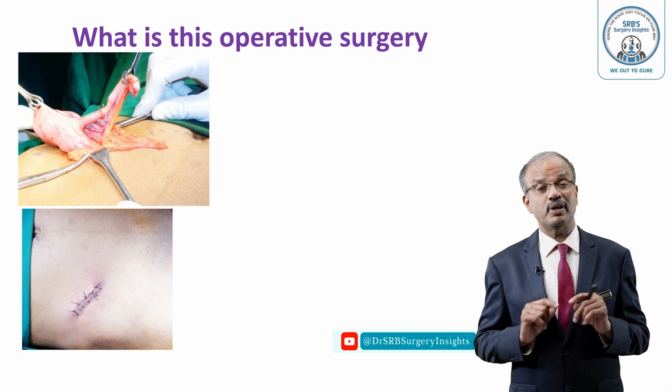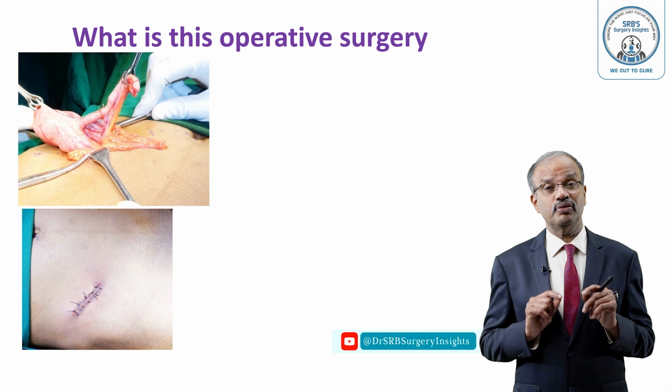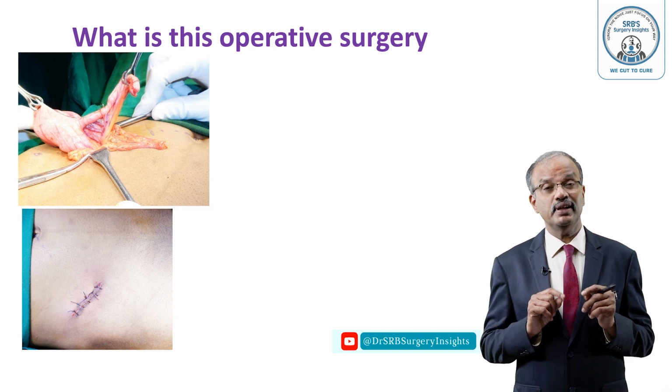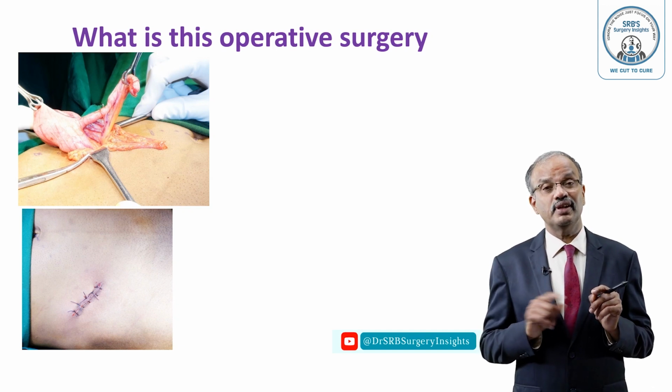Peritoneum, shiny, pearly white peritoneum is identified. It is held with the artery forceps. Bowel should not be held; be careful, you have to feel it. 2 artery forceps are placed. Then you have to cut with the knife obliquely. Then open and see. Confirm that you have not injured the bowel. Then hold the edge of the peritoneum with the artery forceps. Then cut the peritoneum along the line of incision adequately.